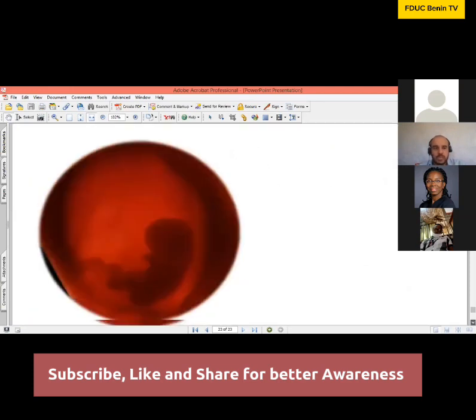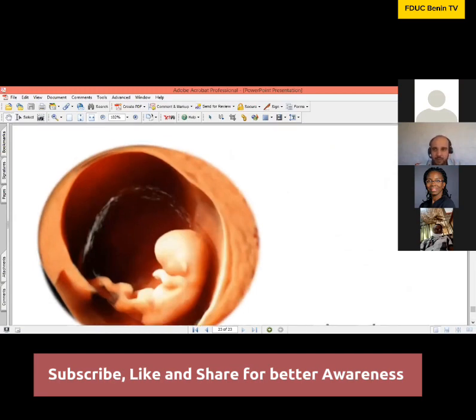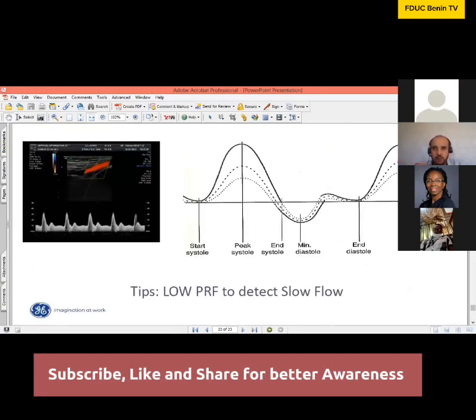The 2D image quality first, then the size of the region of interest, then the gain, of course, because it will overfill or have bleeding outside if you increase it. Then the PRF: decrease it until you get aliasing, and then de-alias. For your pulsed wave Doppler, always put your sample at the center of the artery, and then decrease your PRF a little bit to detect the slow flow.